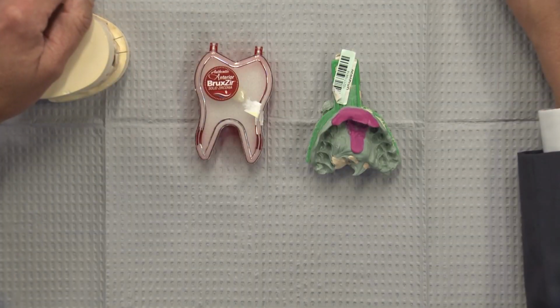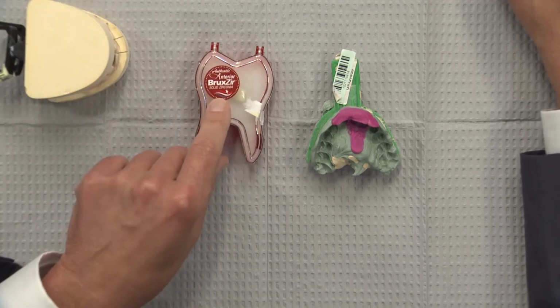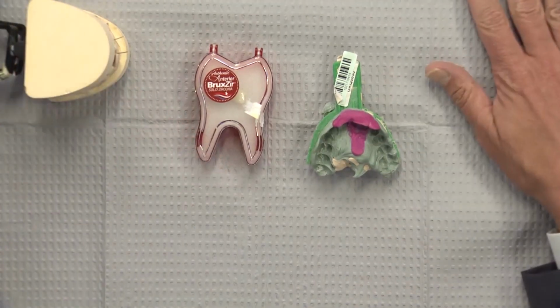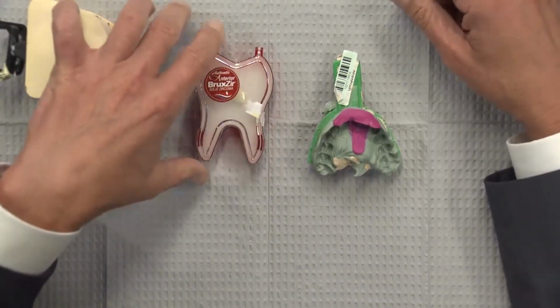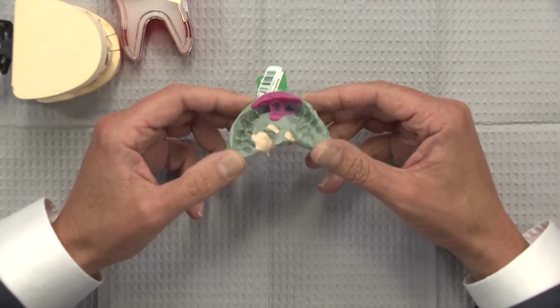We've talked before on the show about anterior BruxZir and how it's more translucent than regular BruxZir, and of course you can see the anterior BruxZir sticker on the outside of this case. It's an interesting case because the doctor prescribed it, and I want to show you what happened here. Let's take a look at the impression.